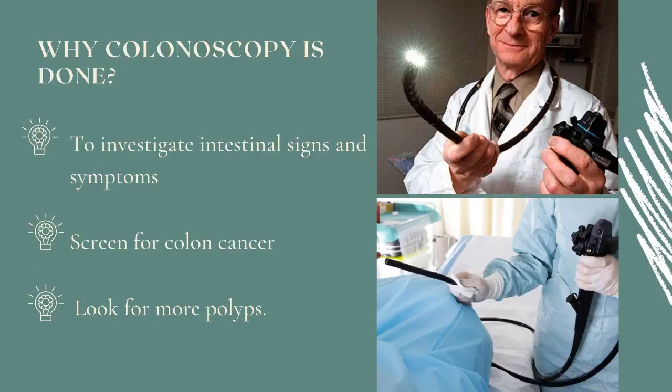Next, we are going to discuss why colonoscopy is done. The doctor may recommend a colonoscopy for the following reasons. To investigate intestinal signs and symptoms: a colonoscopy can help your doctor explore possible causes of abdominal pain, blood in the rectum, chronic constipation, severe diarrhea, and some other related problems.